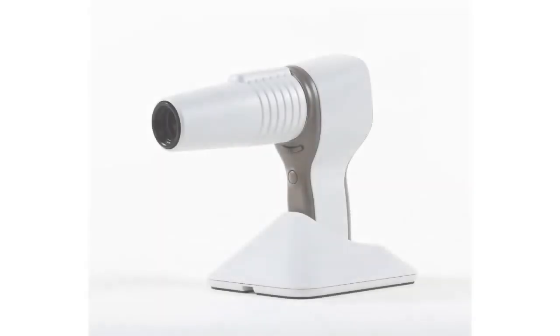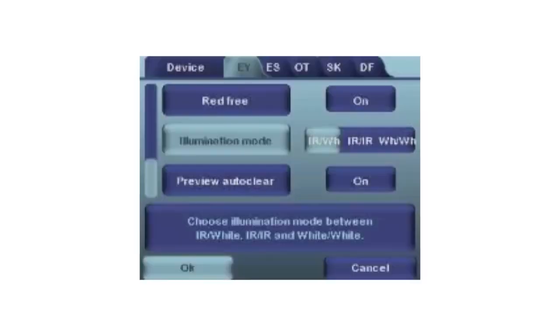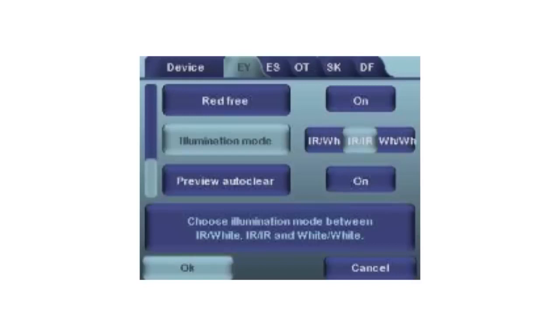Illumination mode: The camera has three different illumination modes which can be changed in the EY menu. As a default setting, infrared light is used for targeting the eye fundus and white light flash is used to capture a true color image. If preferred, the image can also be captured using infrared light only. This will produce a grayish color image.